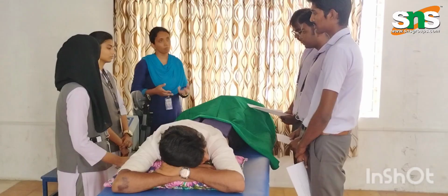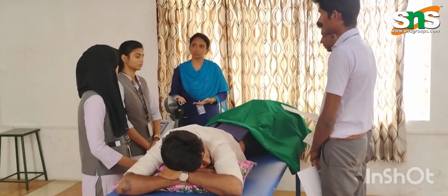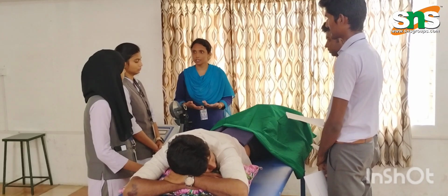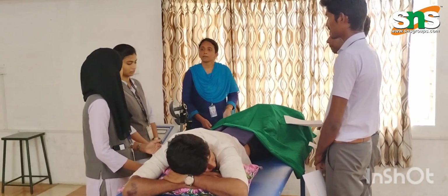For about how many days can we give the treatment? We can give it for at least a week or 2. Then only can we feel a better outcome. So what is next? Next is the application and dosage.